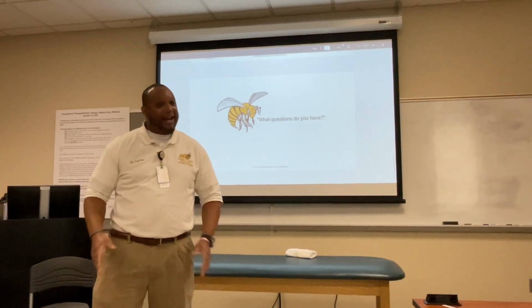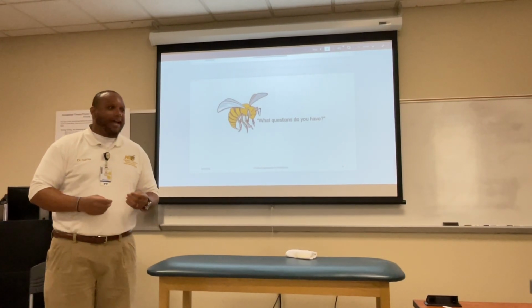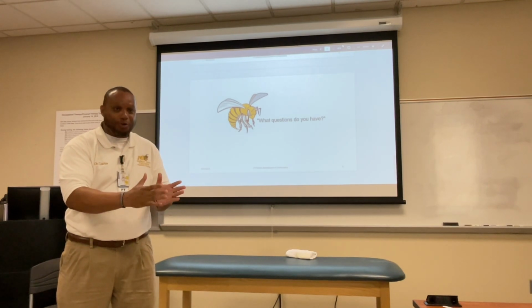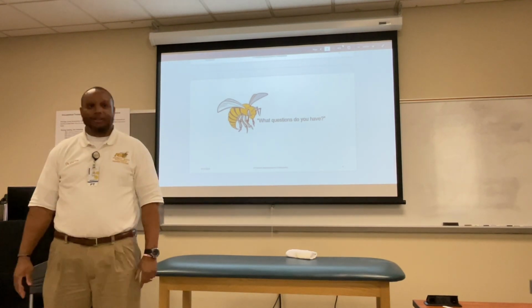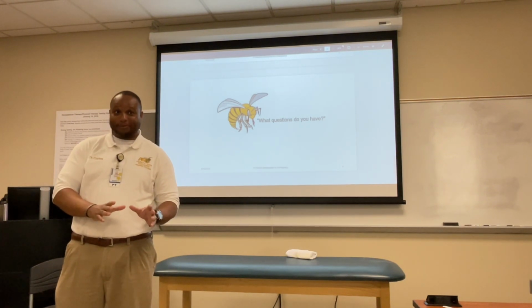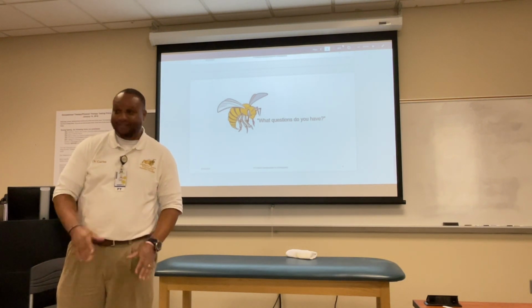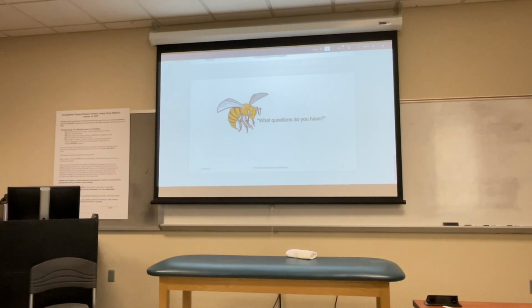You see, they do all kinds of things, believe me. So now you're going to have to give a command: keep your trunk straight. Don't move your trunk, I just want you to move your arm, okay? So that's real life from the clinic. I'm giving you a real life example of what patients have done to try to get more range of motion, okay? All right, with hip flexion, this is what they do.